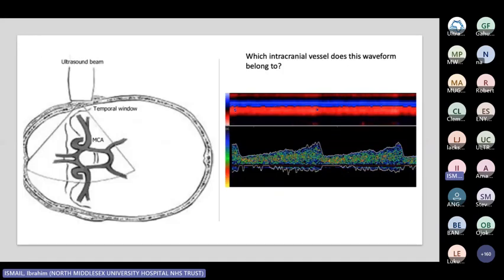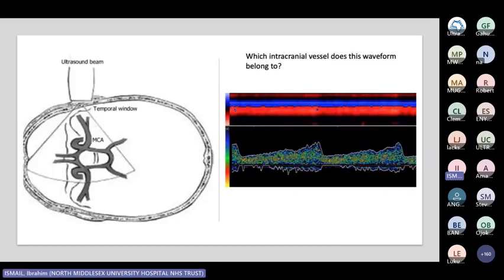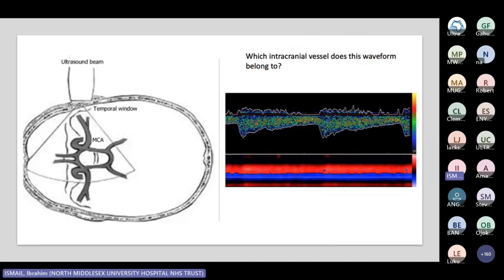Let's go back to the fundamentals. Since when do you see an upstroke of velocity in a spectral waveform go up and down? I think I'm being unfair here, to be honest. It is quite unfair. And I think Edwin himself fell for it as well. This is just lighthearted, to see if everybody's paying attention. But this is, in fact, the ACA turned upside down. It's just to see if people have attention to detail.